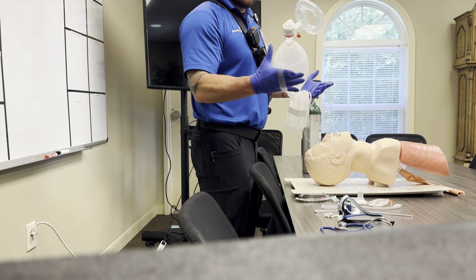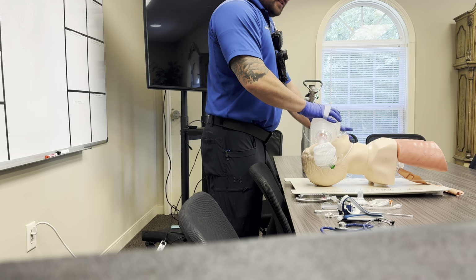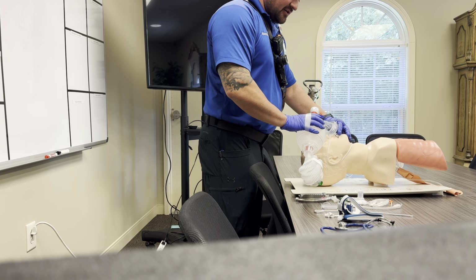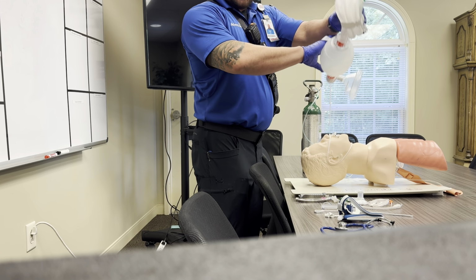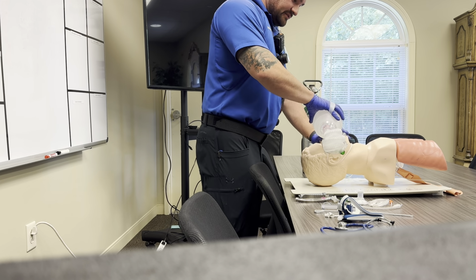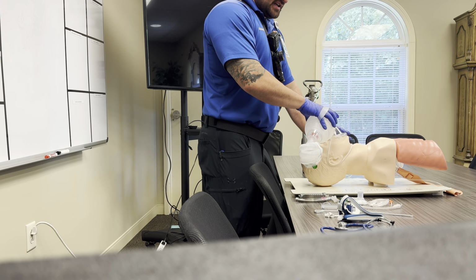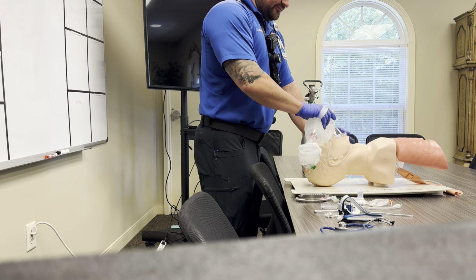At this point, I could take over ventilations from my partner. We're going to make sure we've got a good, appropriate mask seal. So I like the EC method. I have a bigger hand, so it's a little bit easier for me. So making sure that we have the airway open. Airway is open. We've got our OPA in, pre-oxygenating using oxygen. And then our BVM would also be attached to another oxygen source, whether it's the one coming from the wall or a spare tank. So gonna ventilate our patient for about a minute, approximately 10 to 12 breaths. You're gonna make sure you have good chest rise and fall. Make sure you're letting that patient exhale all their air.